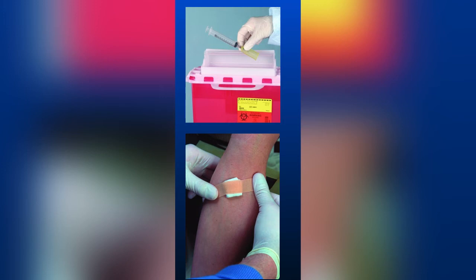Dispose of used and contaminated material. Thank patient, remove gloves and sanitize hands. Transport specimen to the lab.